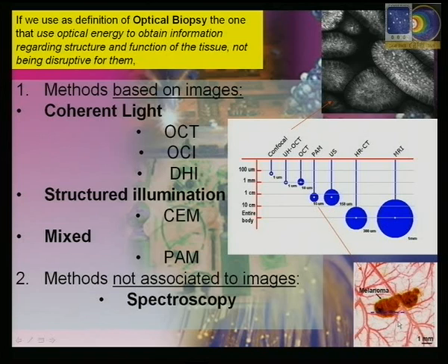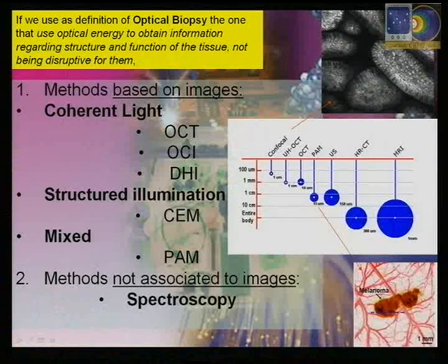This is the case of the photoacoustic microscopy that we will see later on, in which you can see on the skin, not just on the surface but deep inside, a melanoma area infiltrating the vessels which are in the subcutaneous tissue.